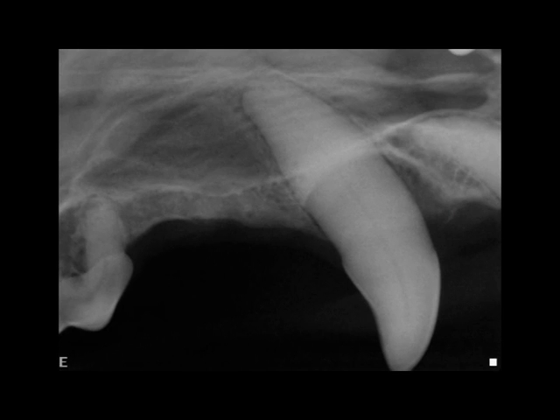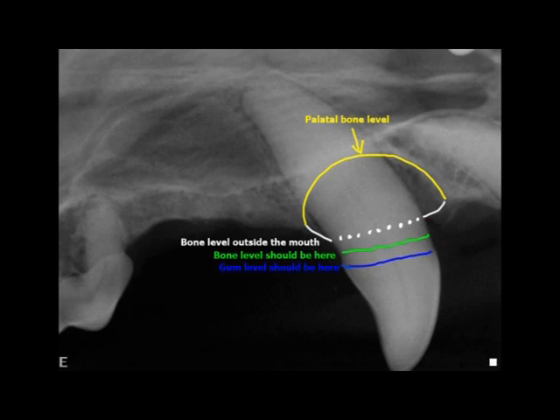The only way we can see bone is with x-rays. This is the only way we can diagnose periodontal disease because it is a disease of bone loss and you can only see that with x-rays. In the x-ray of the tooth, the yellow line shows you where the bone of the palate is, and the white line shows you where the bone on the outside of the tooth is. But where the bone should be is where the green line is, so there is a lot of bone loss on the side of the palate. The x-rays go through the gums, which should be where the blue line is, so you don't see the gums on x-ray — just the bone.